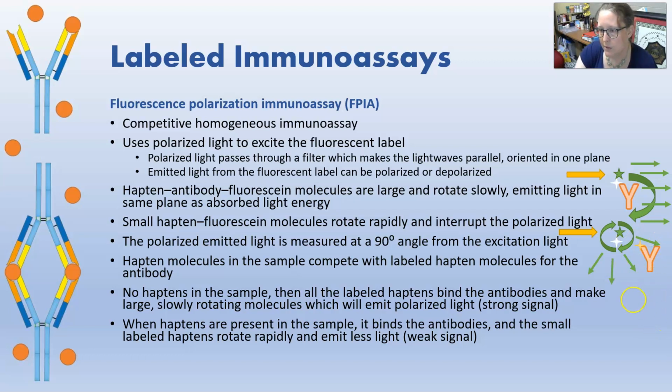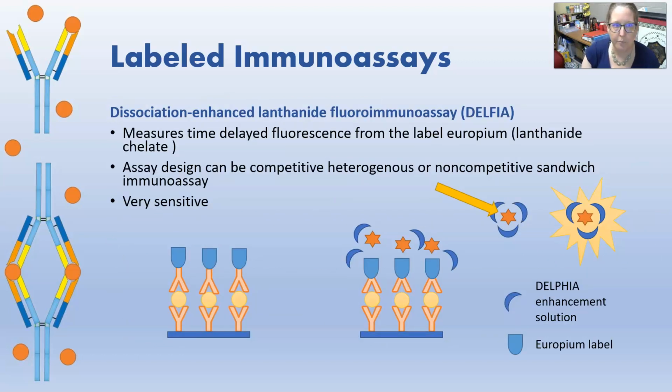And so that's because the antibodies were picked up by the sample. The sample hapten picked up all the antibodies, and so you just have the labeled hapten spinning like crazy and not being detected.